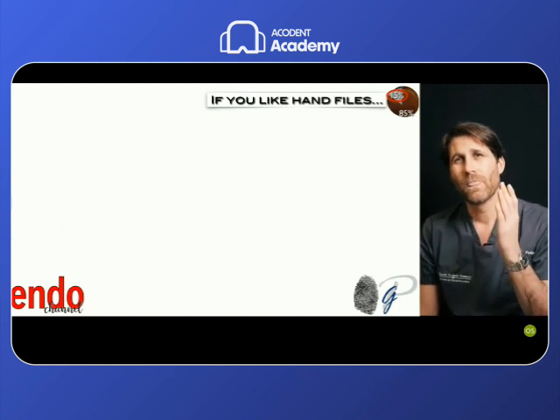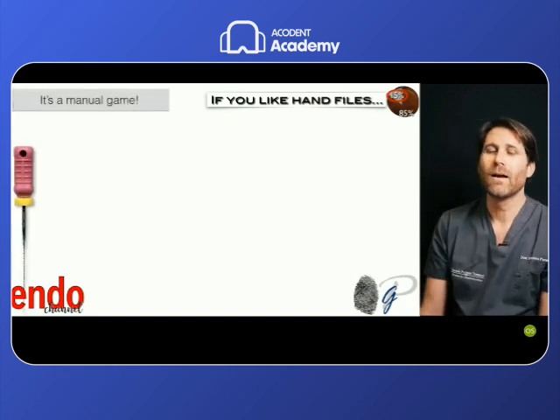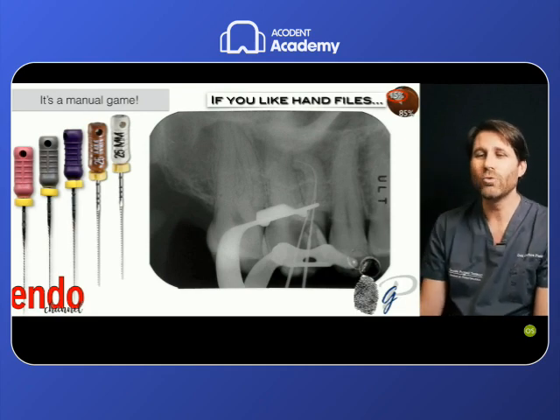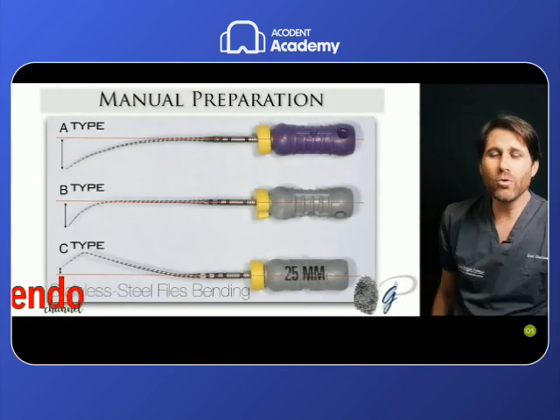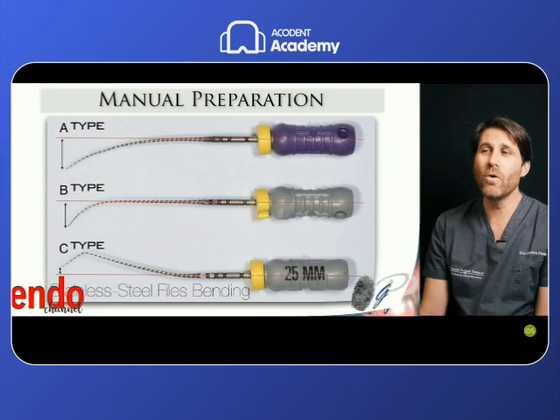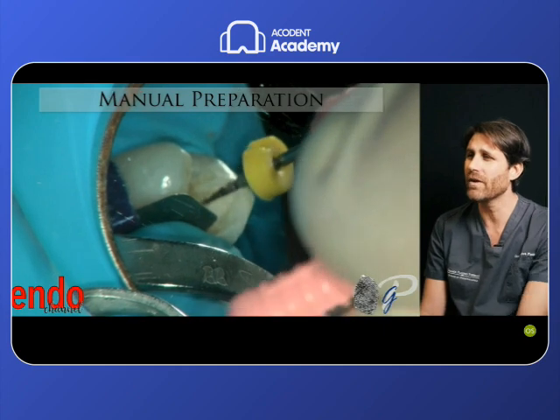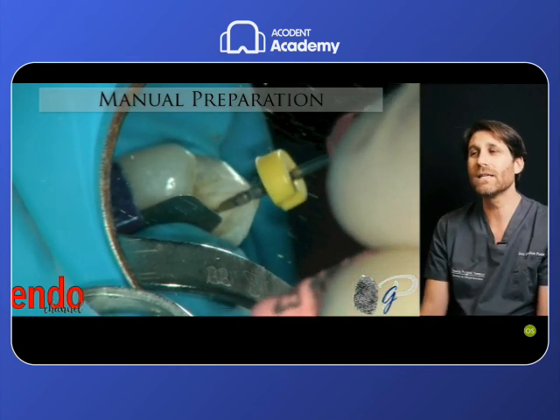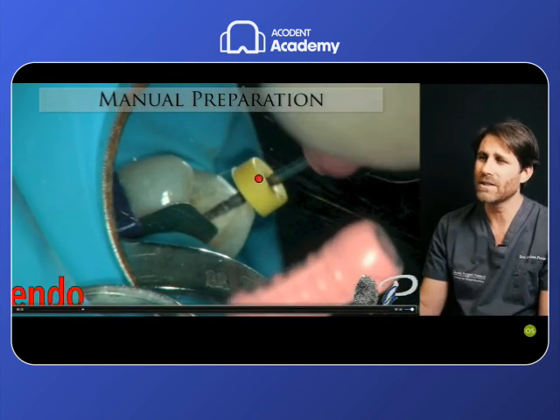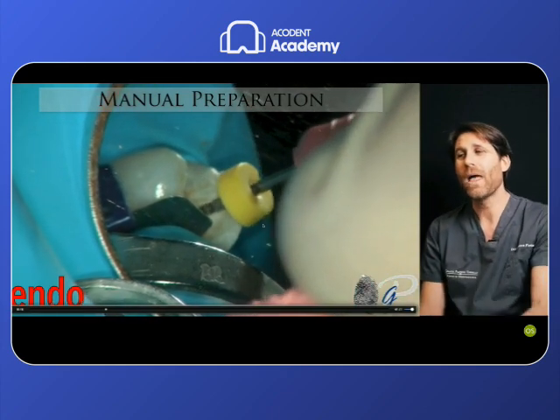A rotary file was used up to the impediment, and then we needed to use manual files with a manual game, using files 6, 8, 10, alternating small files to reach the working length with different precurvatures of the file to follow the root canal anatomy. But this was a manual game, manual preparation of the apical third, very difficult, very time consuming, very demanding, requiring a very skilled clinician. We use a precurvature, we put the rubber stop with the sign towards the precurvature, we alternate the rotation, and then we find the way of this apical third unscoutable.